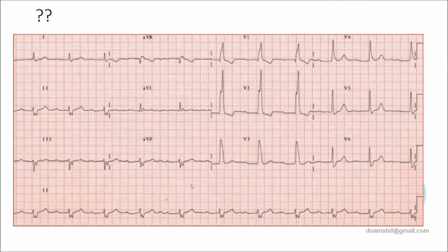What could it be? Left bundle branch block. Why are you saying V5, V6 is the wide QRS? In lead 2, there is a W pattern. Okay. So there is some additional information to show you. We are thinking that there is some block. If a block is there, it may be bundle branch block. There may be fascicular block.